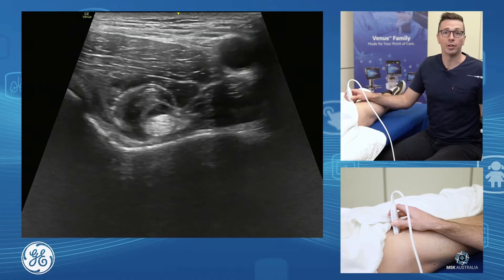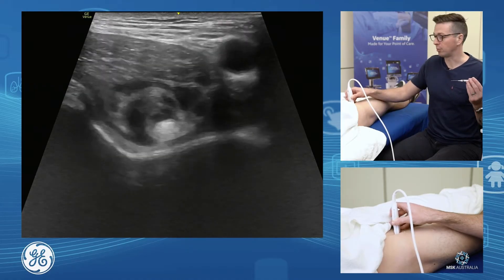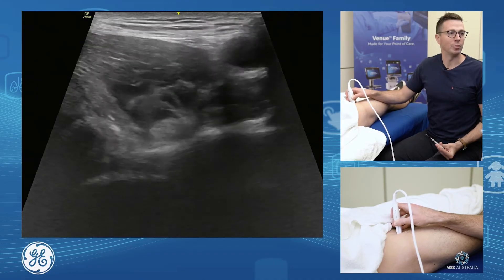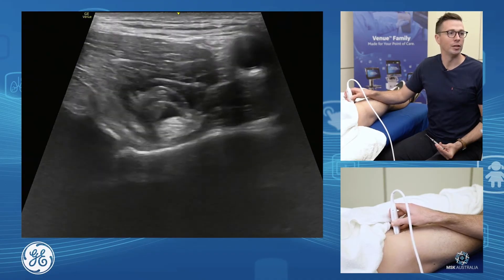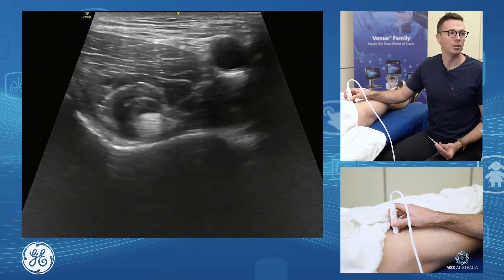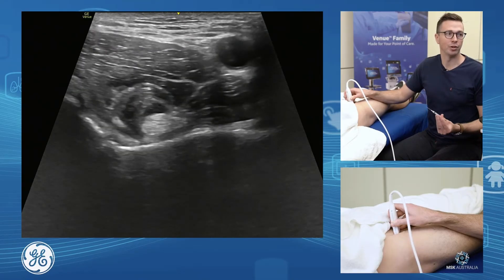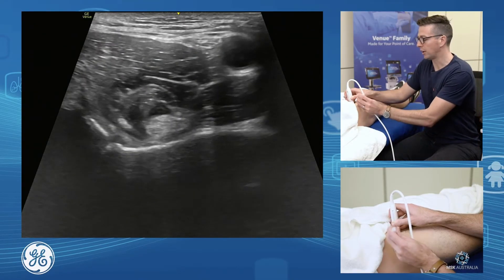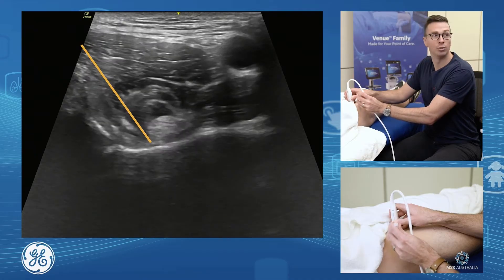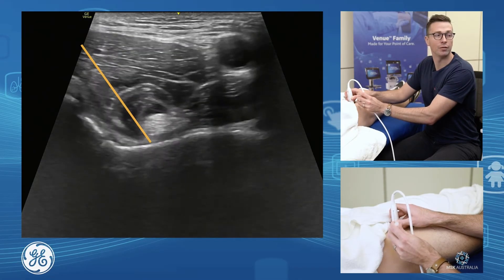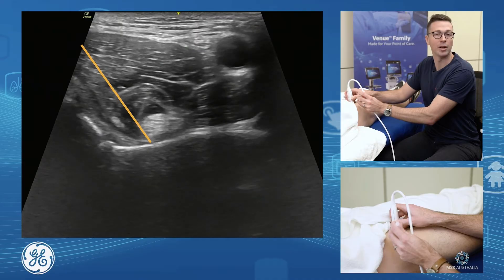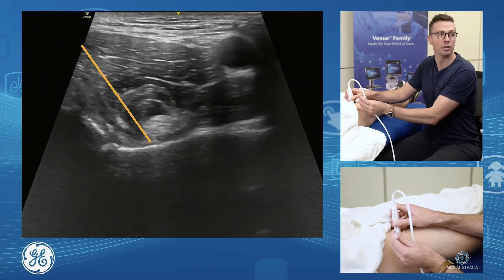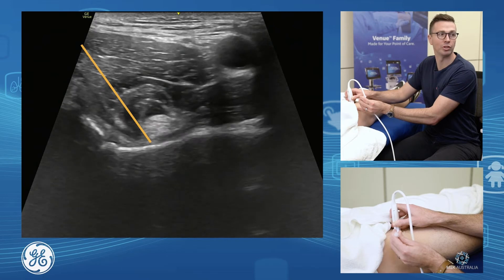If we were to do an iliopsoas bursal injection, this is the approach we would use. Find your iliopsoas tendon sitting at the top — find your head, acetabulum, line yourself up, fix your anisotropy, and get a nice approach in here. Bring your needle in at about a 45 degree angle laterally, and slip down to hit the top of the acetabulum. Slip underneath the tendon, in onto the acetabulum to do your iliopsoas bursal injection.